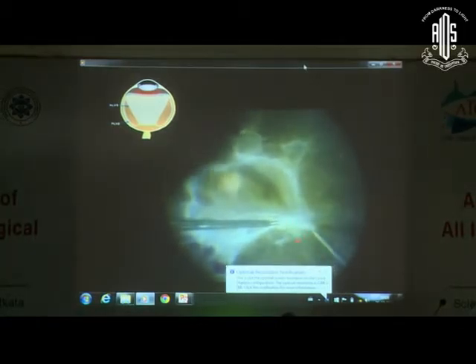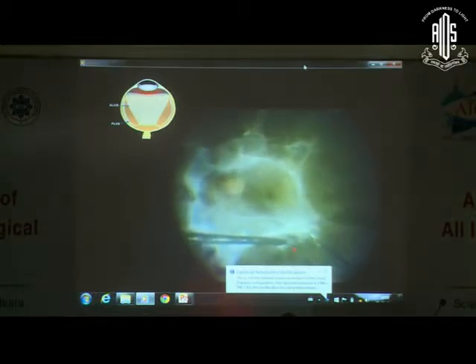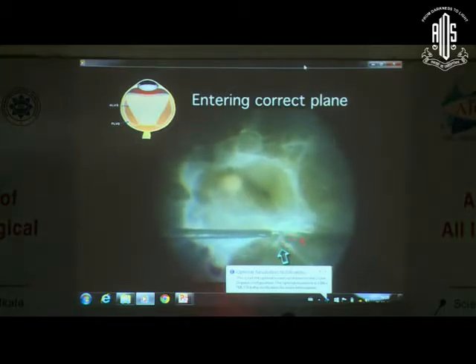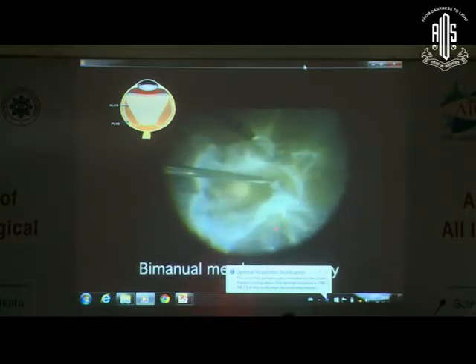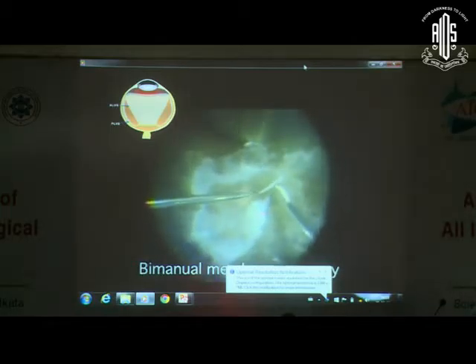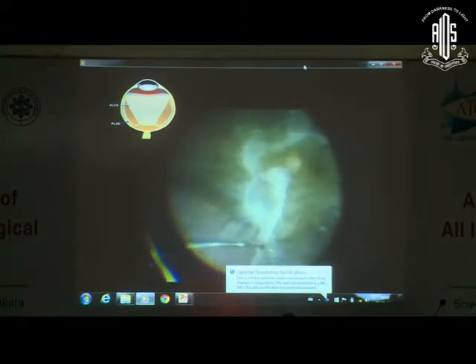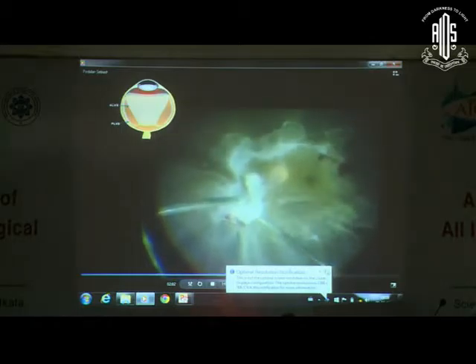You're actually cutting into the tissue, and this is the posterior leaf of the vitreous cortex here, which you got left behind, and then the traction raised that edge, and when you got actually into that edge, now you see how quickly and atraumatically the dissection proceeds, because you can accurately see every vascular connection and cut it as you encounter it. And now you proceed this way and then remove the entire tissue.